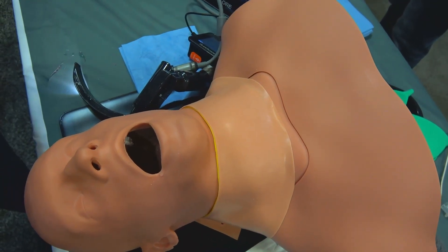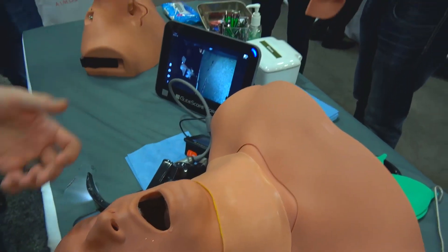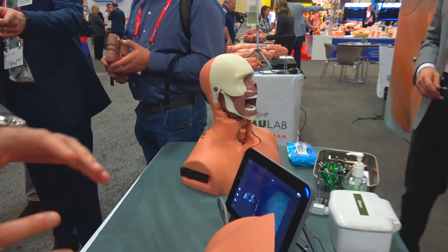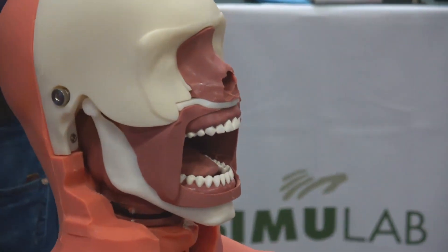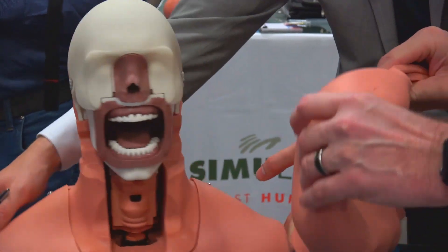The other end of the spectrum is soft tissue airway trainers that are very expensive and maybe not as durable as we would like, and maybe not so easy to interchange parts and make sure that this system is in use at all times while you have high volume of training using this airway system.